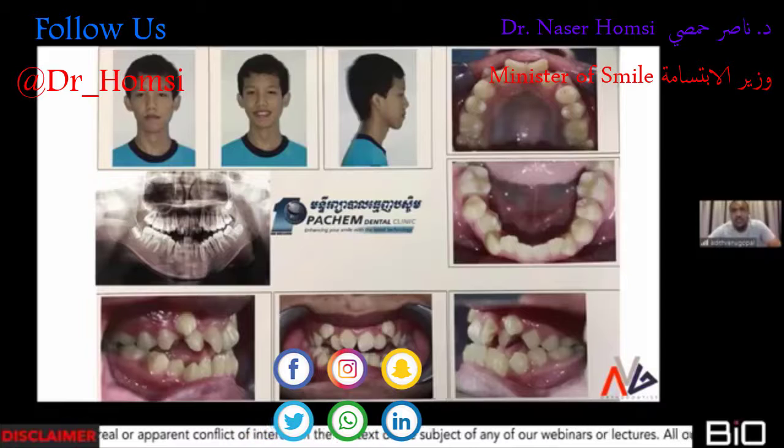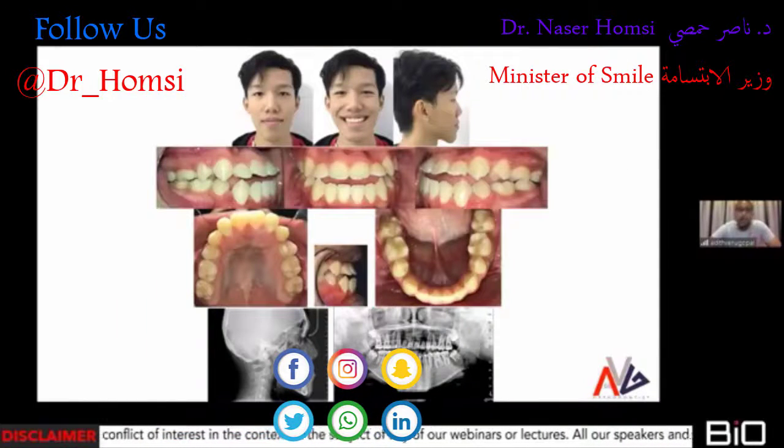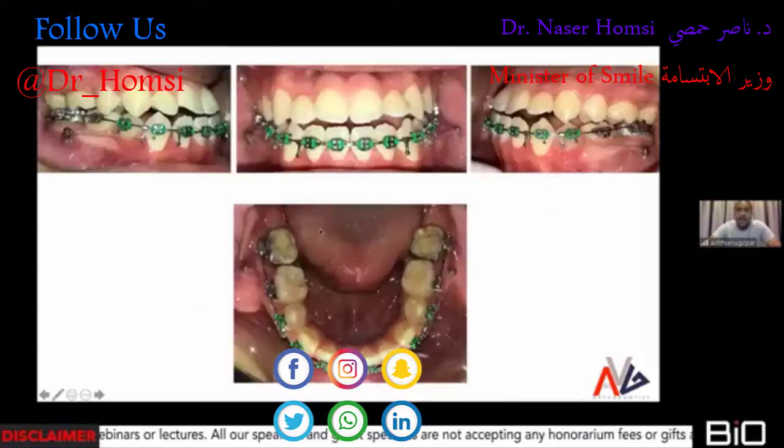Again, a similar case, which all of you have seen again, and this is a loss of anchorage case, retreatment case, in which the patient iatrogenically was led up to a situation like this. And I had to use the brackets, which are conventional because the patient was already undergoing treatment for a long time. As you can see, the inclination of all his teeth are really proclined. The roots are right outside the palatal bone.